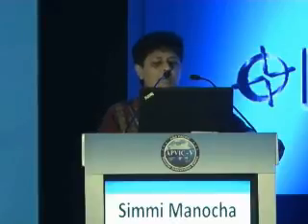Color Doppler utilizes the pulse echo Doppler flow principles to generate a color image. This image is superimposed upon the 2D image. The red and blue display provides information regarding the direction and velocity of flow. It is used to visualize the blood flow and differentiate it from the surrounding tissue. It provides a map for placing a Doppler sample volume, and the basic questions answered are, is there flow present? What is the direction in which it is traveling, and how fast is it traveling?